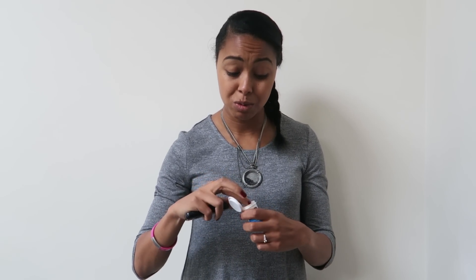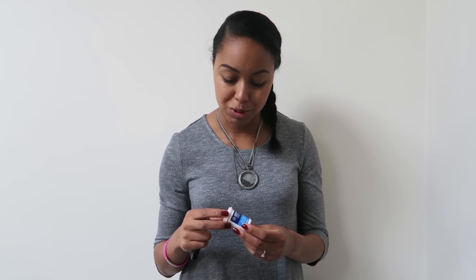Starting with the strips — you get 50 to a box, which is really handy. Even if you're not using the sensor, I go through around six or seven blood strips a day, so having the bigger pot means you're not constantly changing and you don't have to keep carrying loads of strips with you.